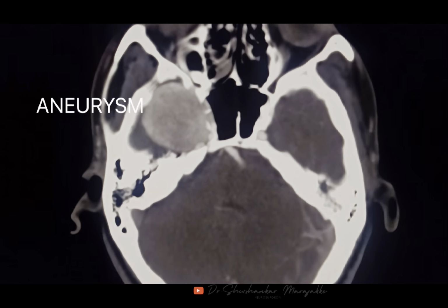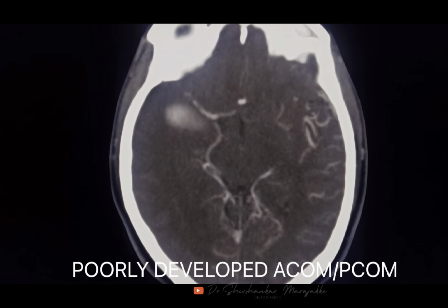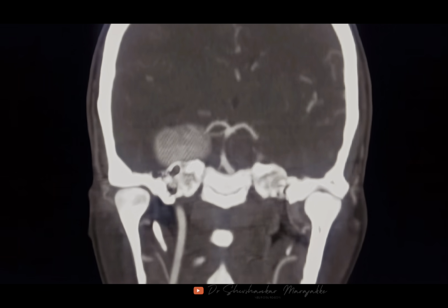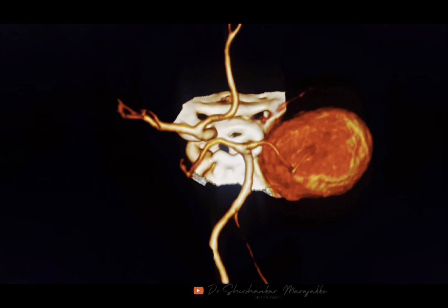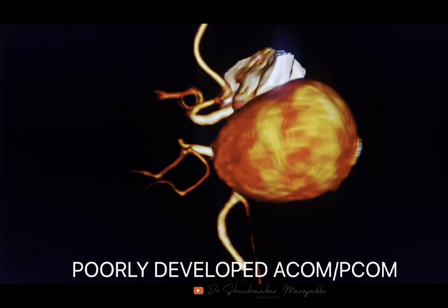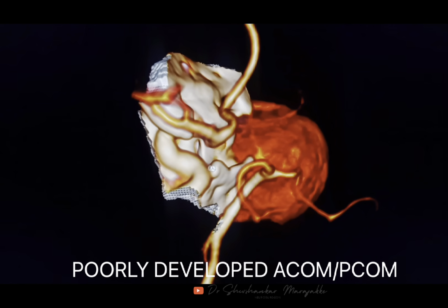So this is another case, a young lady who came with this large unruptured aneurysm, and it is quite large, arising from the cavernous ICA, and in this there was neither ACOM nor PCOM to fill. This is a CT angio. You can see this is a completely filling large aneurysm in a young female arising from the cavernous ICA.